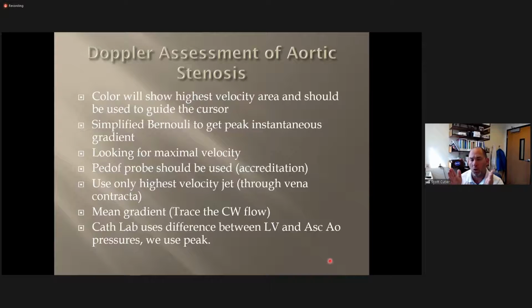So on a normal aortic valve, we're going to do those measurements. We're going to take PW for the LVOT. Typically, we trace the LVOT with our VTI, and typically we will take a continuous wave, but just a peak velocity of the aortic valve itself. When it's normal, that's fine; when it's abnormal and we've got stenosis, we always trace the valve because the tracing gives you more accurate information.